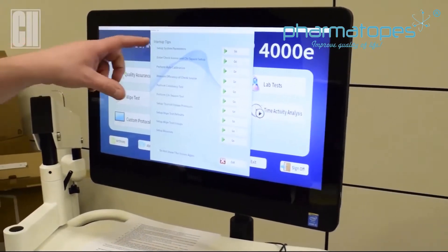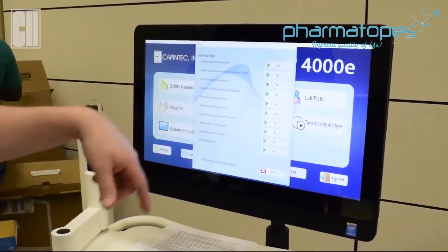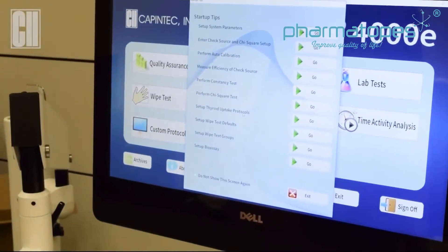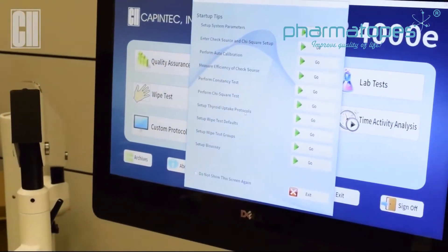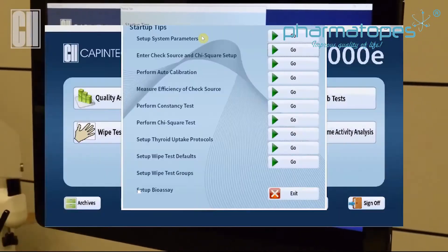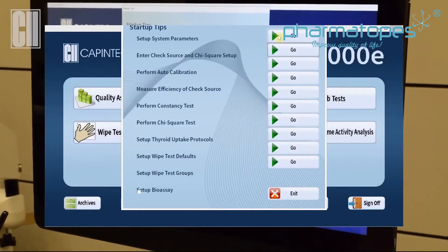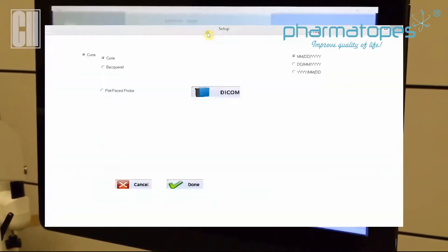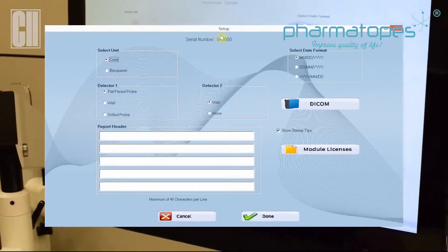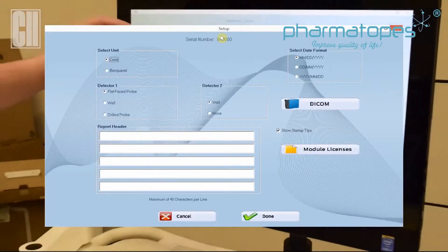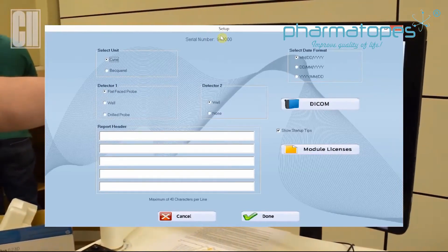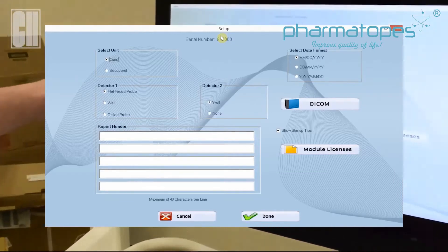It's recommended to go through all of these sections to make sure everything is set up according to each facility. The first step is the system parameters. Once we go into here, we want to make sure we have the correct unit selected, whether it be Curie or Becquerel.